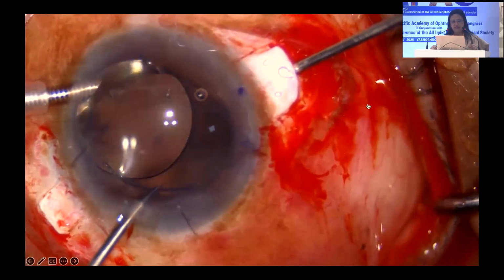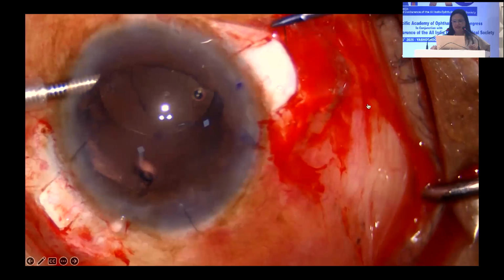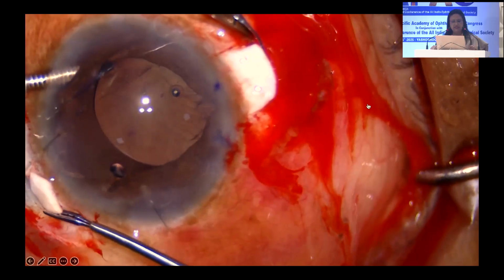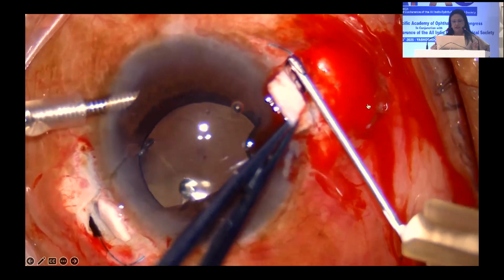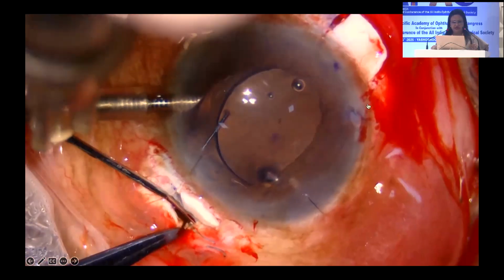You can see that I'm removing the capsular contents, and you can see the handshake technique where the haptics are being exteriorized using an MST forceps, and again the other side it's being exteriorized. In this case, I'm using an AC maintainer. It's very important, either use an AC maintainer or use a posterior infusion. You need to have an infusion on, and now it's tucked into the Scharioth pockets.